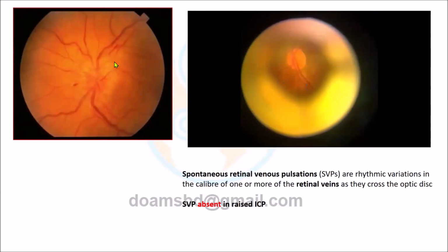After optic atrophy, now I would like to show you papilledema. So, blurred margin. This is papilledema. That means it is a feature of raised intracranial pressure. Now, if in the retina nothing is wrong, without any problem, so it is only papilledema. What could be a possible diagnosis? Please, anyone? Could be?